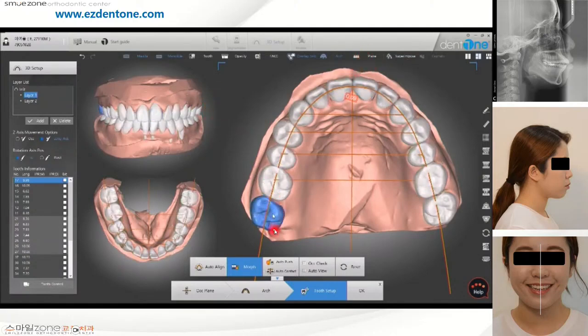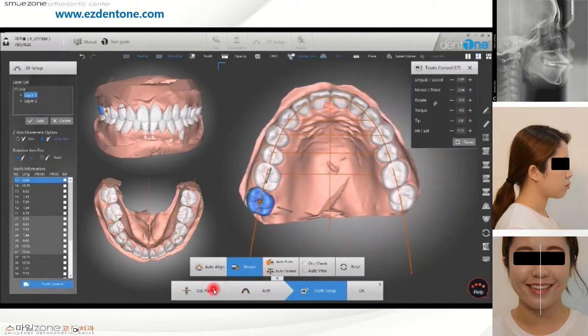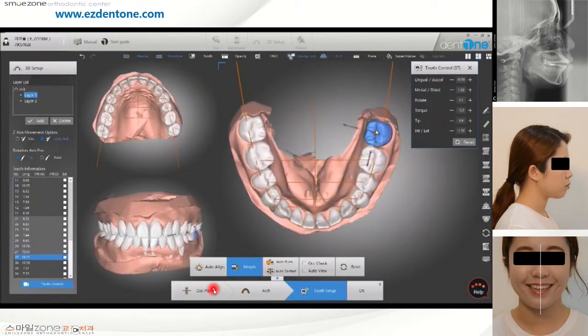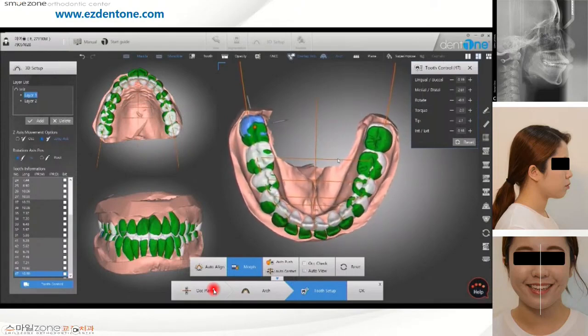Same amount of the anterior retraction, but only the posterior teeth can be moved distally about 2.14 millimeters. И оказалось, что в данном случае понадобится дистализация маляров где-то примерно на 2 с небольшим миллиметра. It helped me to decide, okay, I can treat these cases non-extraction if I push the second molar 2.1 millimeter around approximately, then I can treat this one non-extraction. Получается, в данном случае я понял, что без удаления, если я смогу провести дистализацию примерно на 2 миллиметра, я смогу вылечить эту пациентку.